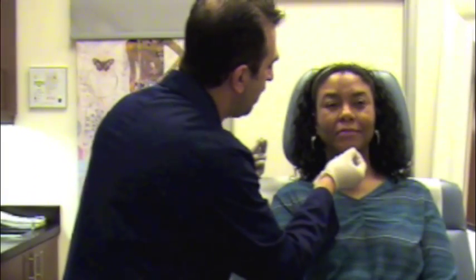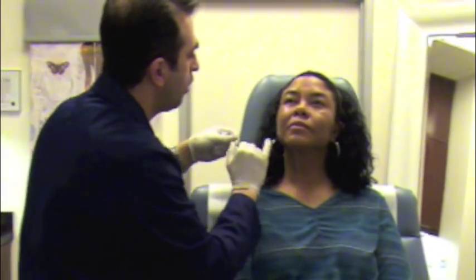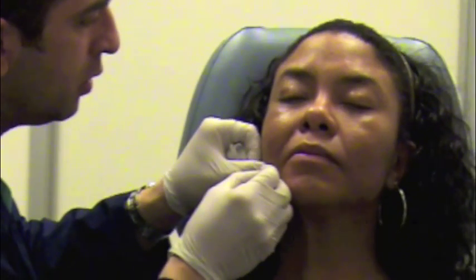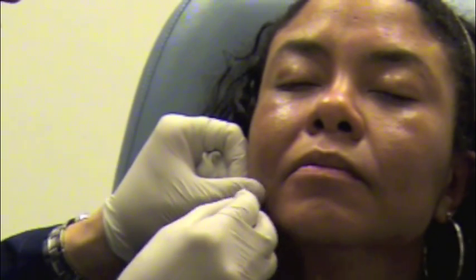Lynn, was that comfortable? Was that okay? Painless. I'm going to have you bring your chin up a little bit this way for me. Thank you. You are going to feel a quick little pinch right over here. Take a nice deep breath in and out. Excellent. Quick little pinch. As I was telling you, you can also take a look at it yourself if you're interested.